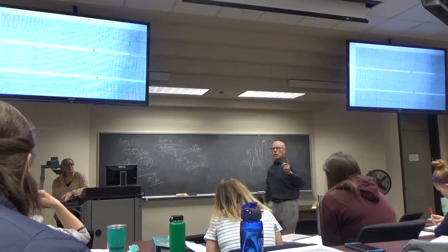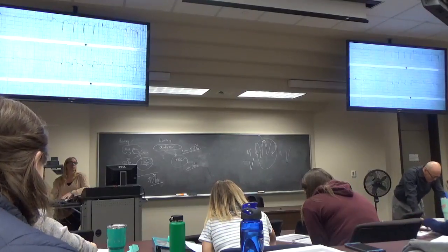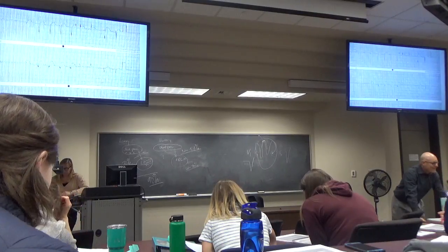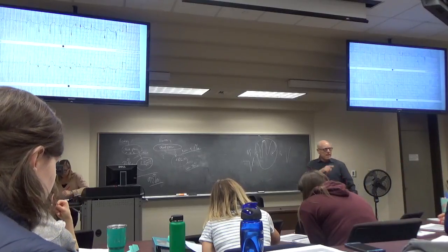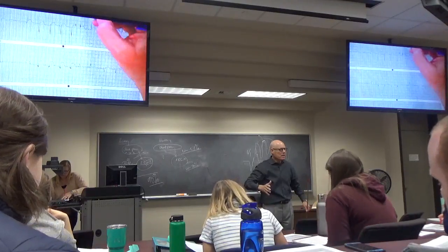Okay, look at V4. After the transition between V1 and V4, the QRS looks different. It can't be different, can it? Well, it can, but it's not supposed to. You're not supposed to have one QRS up like this and the other QRS down like, what the hell? What does that mean? Yeah, you do.